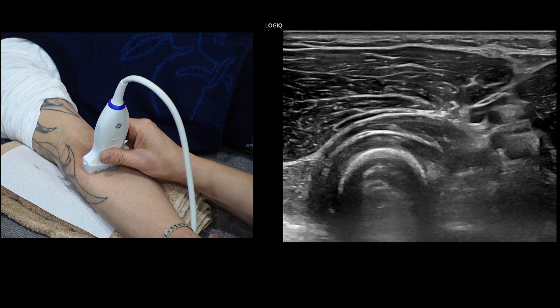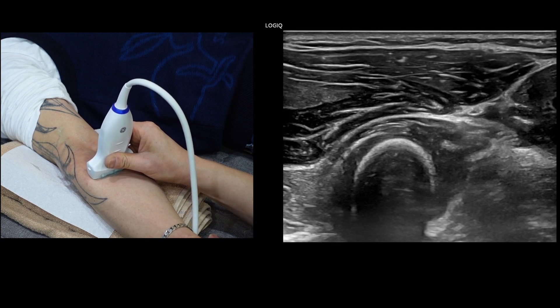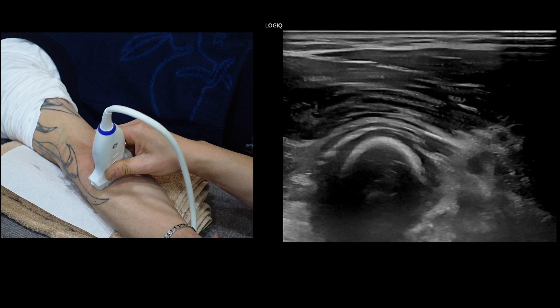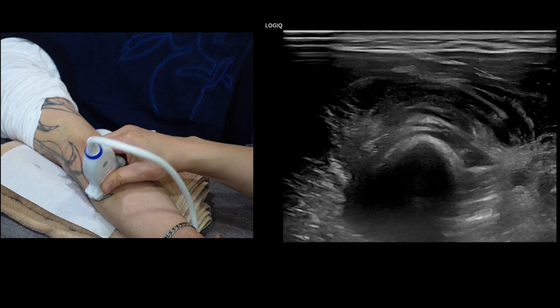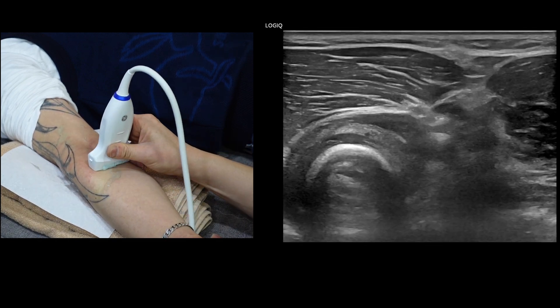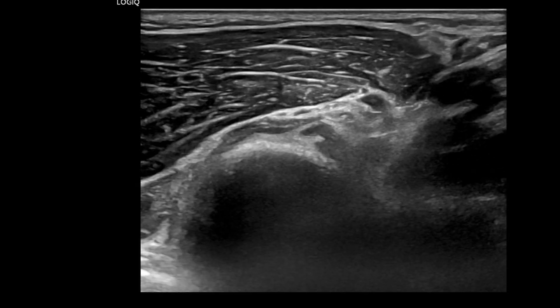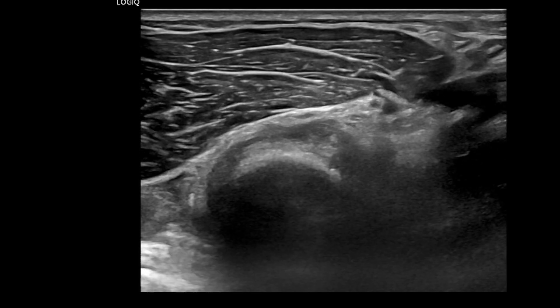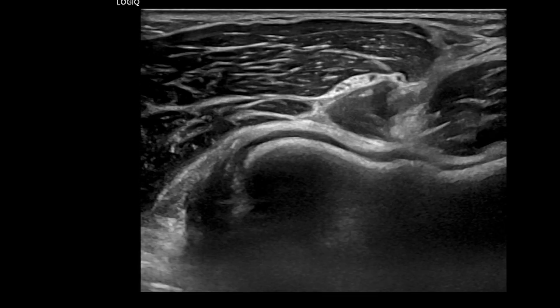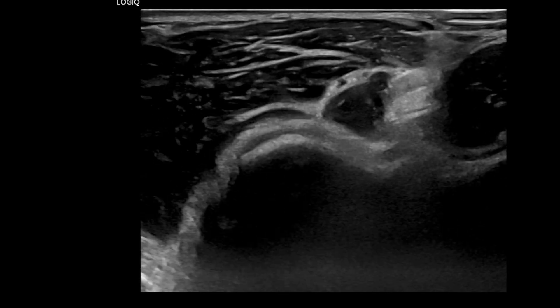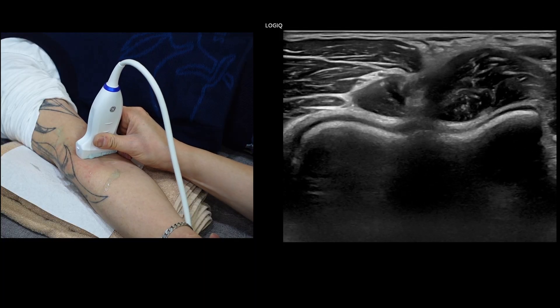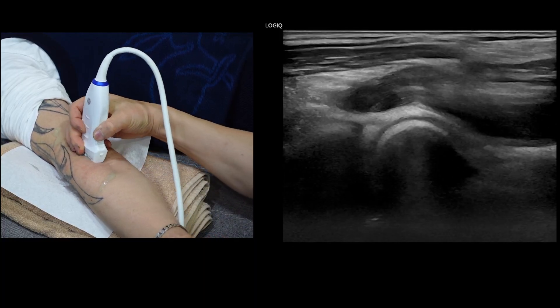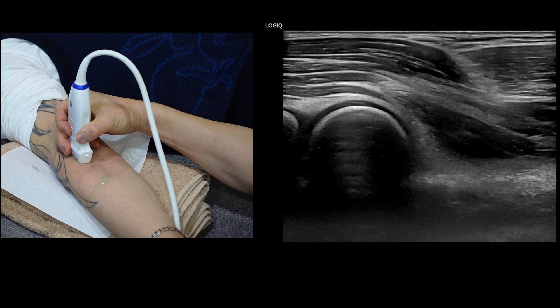Meticulous attention is given to the deep radial nerve as it traverses Froese's canal, located at the entrance between the two muscle bundles of the supinator muscle. We will compare the nerve size in this space before and after Froese's canal. Subsequently, we will assess the coronoid fossa to evaluate fluid levels and joint pathology.